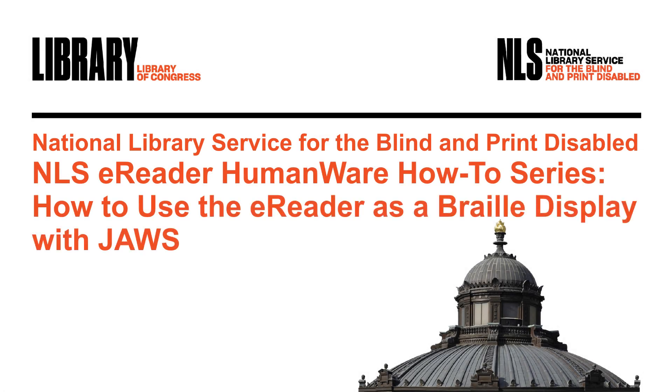NLS eReader HumanWare How-To Series: How to use the eReader as a Braille display with JAWS. Hi, I'm Judy Dixon, Consumer Relations Officer at NLS. In this edition of the NLS eReader How-To Series, I am going to cover how to use the eReader as a Braille display for the JAWS screen reader.